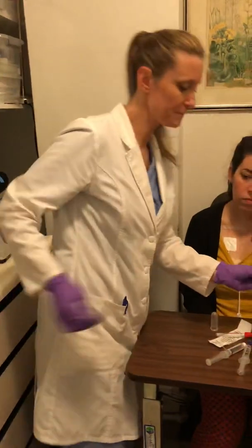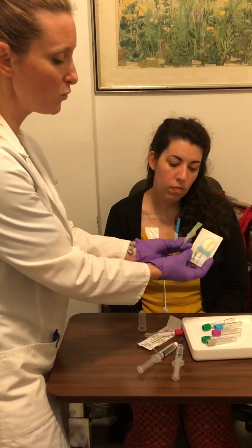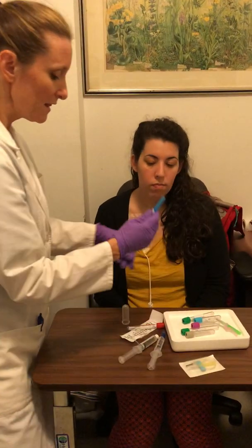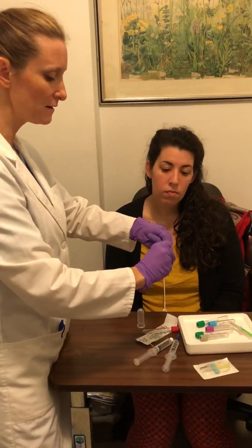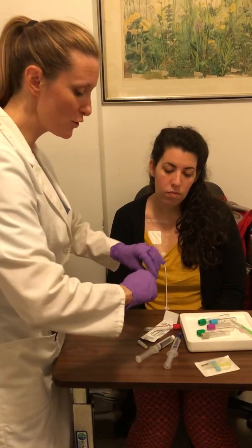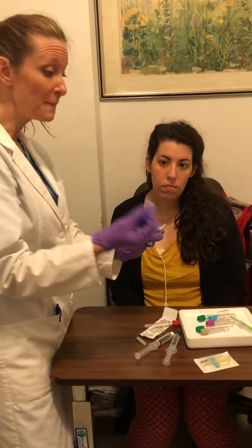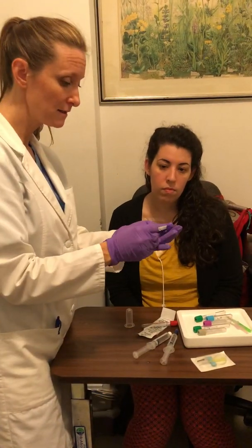They give you two needles in the kit. You have your standard butterfly — no matter which needle you end up with, you can draw from these two options. This needle specifically put in the kit for drawing from a line: when you open it, there's no needle at the end, just a flat top. This is the needleless system for drawing blood. You can use this if you get a kit that contains a needleless system.